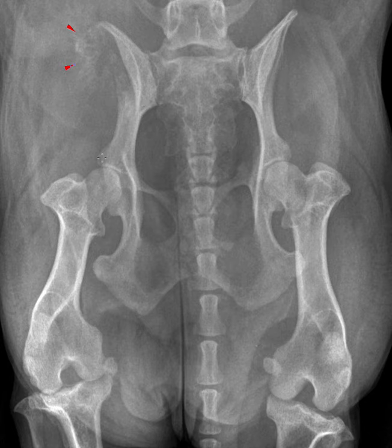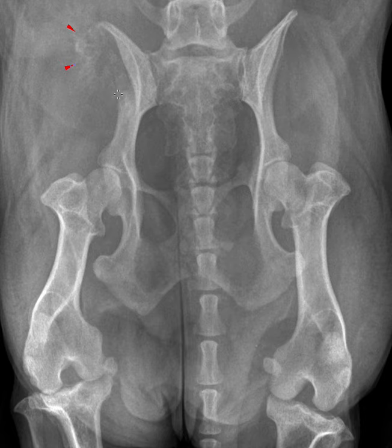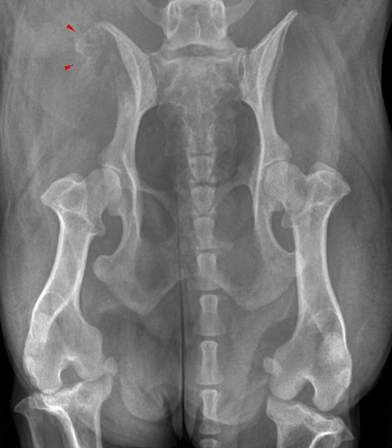When I trace the cortex of the bone on all views, when I come up to this area, you start to see that I'm losing that ability to trace the bone. It becomes very indistinct. And then from there, there's this sort of amorphic, partially mineralized feature, which I've put some arrows on, that really kind of sticks out the side.